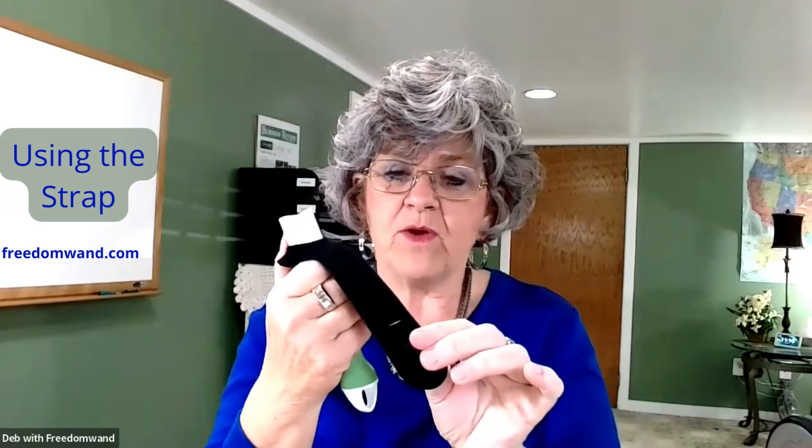The strap has got one hole on one side and three slices on the other. That is for a small, medium, and large size hand. With your handle, you put the strap over one end, then you pull it over your hand and put it through the other to give you the leverage. It will size to whatever size you might need.